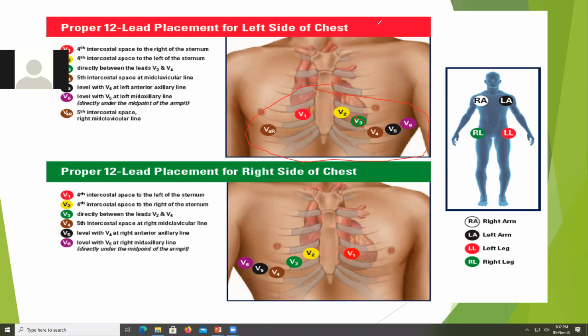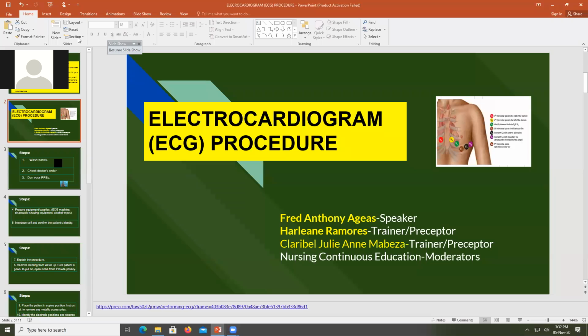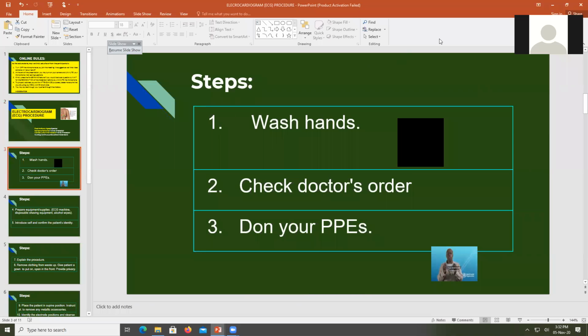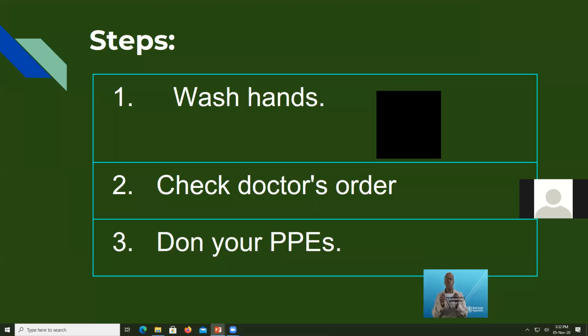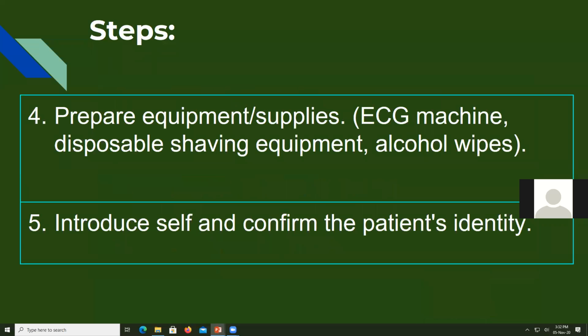Lastly, I need to discuss this one because this would be the basis of your return demonstration. We're done with the ECG interpretation, the basics, and let me just discuss this one. For those who will have the return demonstration, we have to remember first we have to wash our hands first. Then check the doctor's order, don your PPEs, then prepare equipment: the ECG machine, the disposable shaving equipment, alcohol wipes.